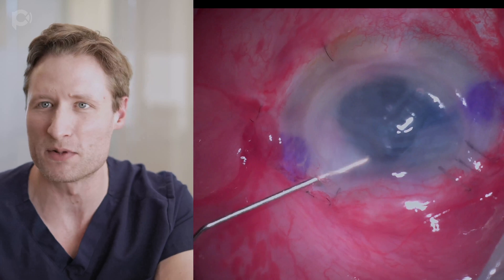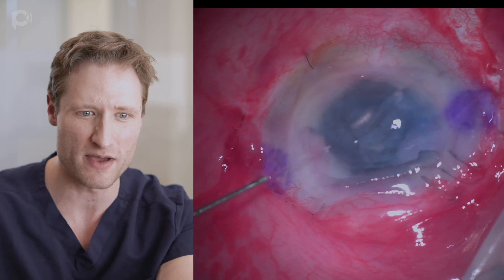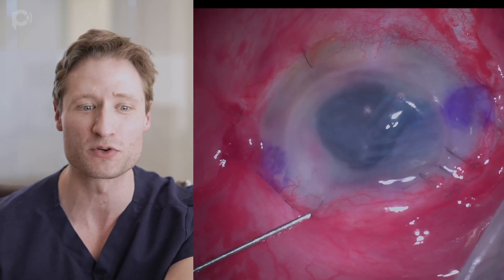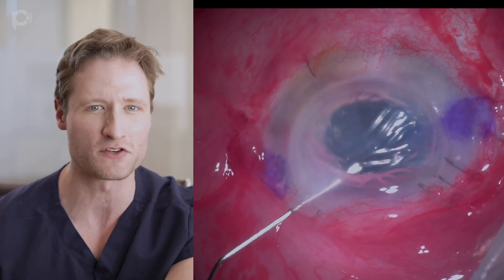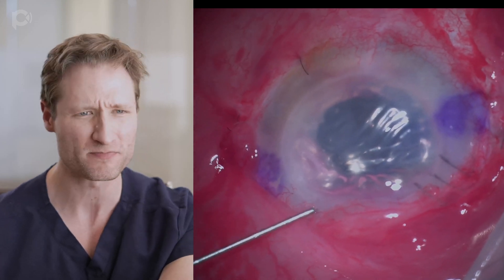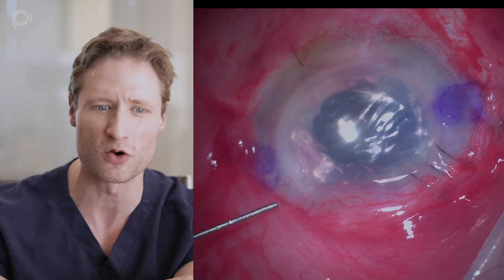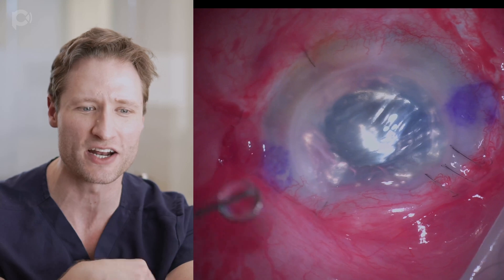This is a far cry from a no-touch technique, but in my opinion, when you're dealing with these complicated DMEK cases, you really have to unfold the graft by any means necessary. If you're obsessed with avoiding direct physical contact with the graft, I think you're barking up the wrong tree. You want to get the graft open. I am not gun-shy at all about grabbing it and dragging it. Sometimes in eyes like this you have to directly engage the graft to figure out what's going on.